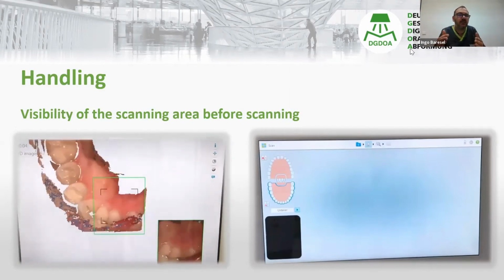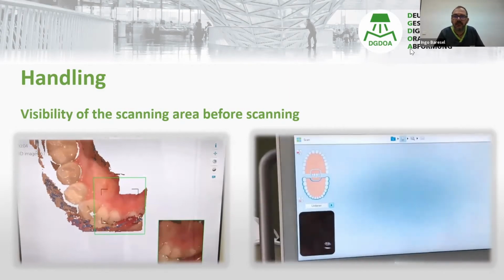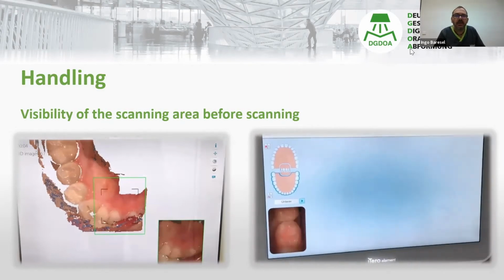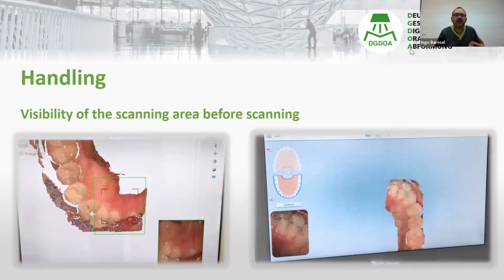So lucky me, I was on the right way. But the other possibility is you grab the scanner, place it to the patient's mouth, you see where you are, and then start scanning. A little tool, but very helpful.